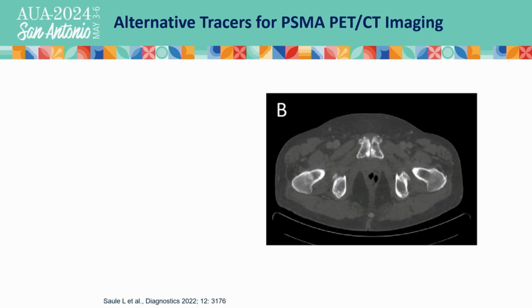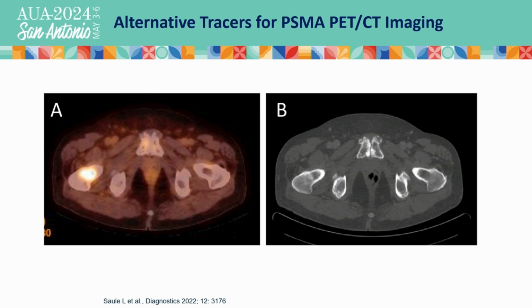So this is an example. You have your plain CT scan of the small pelvis, which apparently looks quite normal. If you use the F18 tracer, you will see this very small, or not very small, PSMA avid lesion. Going back to the native CT, there might be a zone of sclerosis, which could be everything, metastatic disease or benign disease, but this F18 1007 tracer will give you the identification of a metastatic lesion.